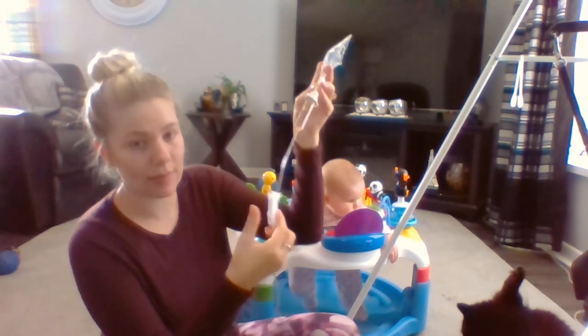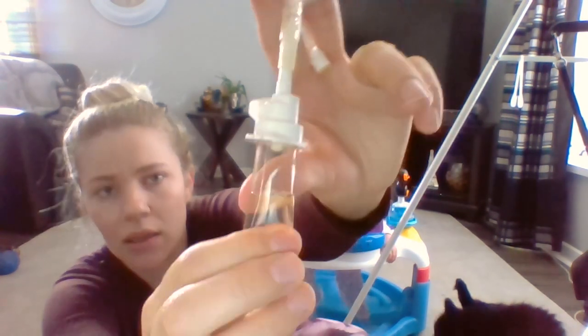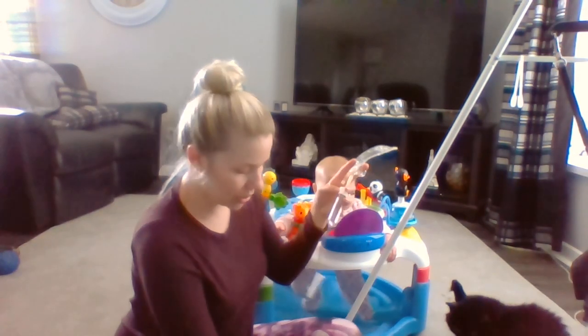First things first, though, you want to make sure that the clamp is shut. All your clamps are shut. So that's going. Next, the drop chamber. You just want to push it until it's about halfway, three-quarters of the way full. And then we are going to prime the line.